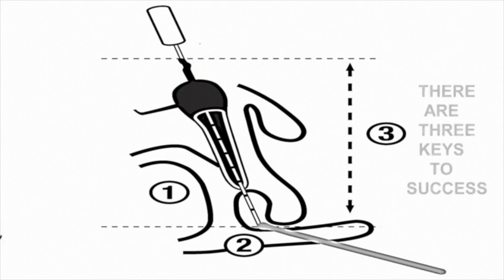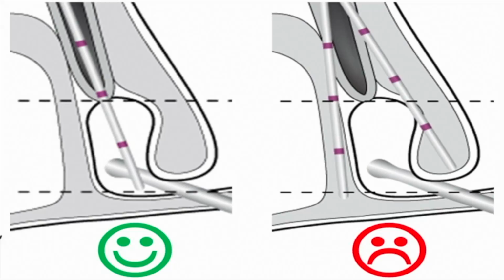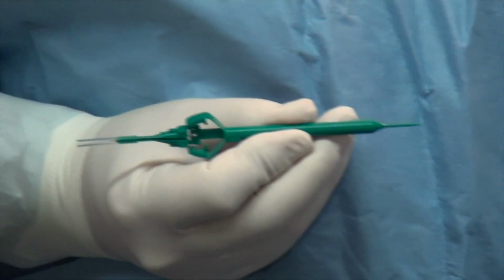Keys to success. The importance of carrying out a diagnostic lacrimal probing on the operating table should be emphasized. It is this step that defines technique selection for treating nasolacrimal imperforations in infants. There are 3 keys to success. 1. Differentiating between simple and complex nasolacrimal obstructions. 2. Good metal-to-metal contact. 3. Sufficient MASTERKA length to extend from the punctum and through the valve of Hasner.